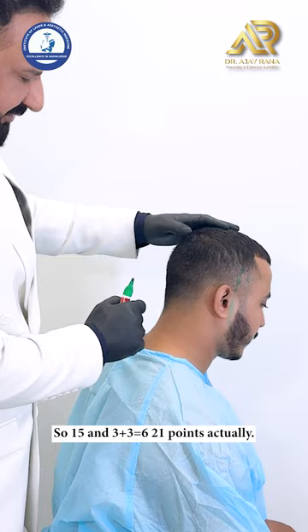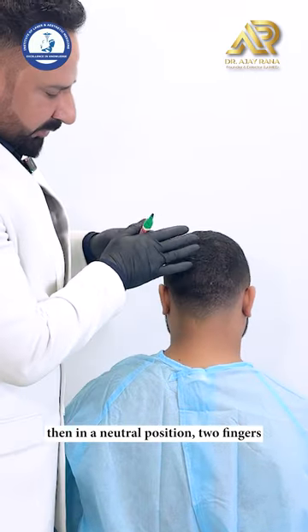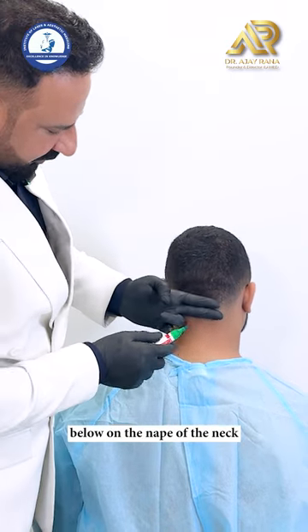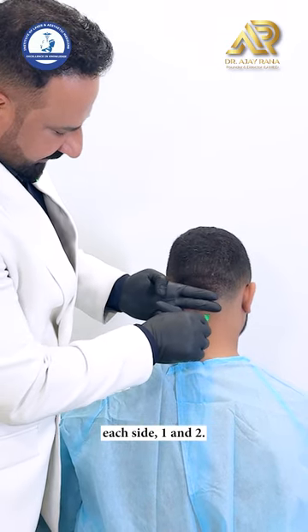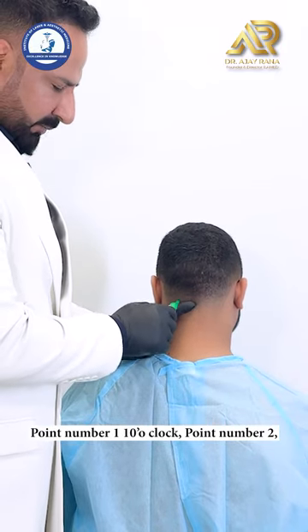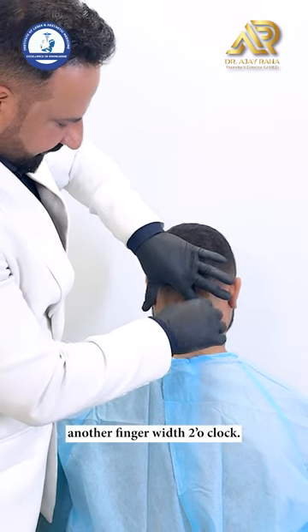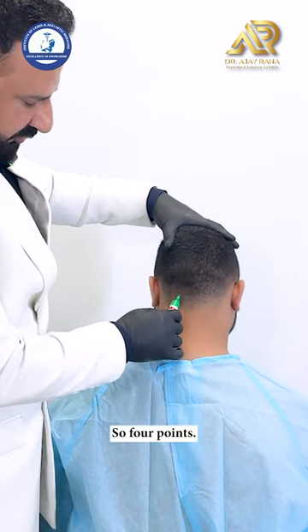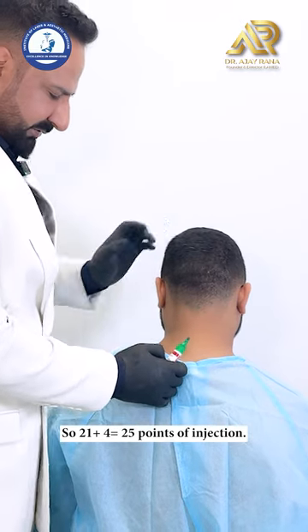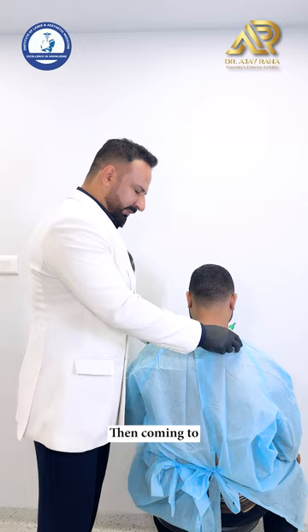With the neck in a neutral position, inject two fingers below in the groove on the nape of the neck each side. Point number one at 10 o'clock and point number two another finger width at 2 o'clock — four points total for the nape of the neck, bringing the running total to 25 points.